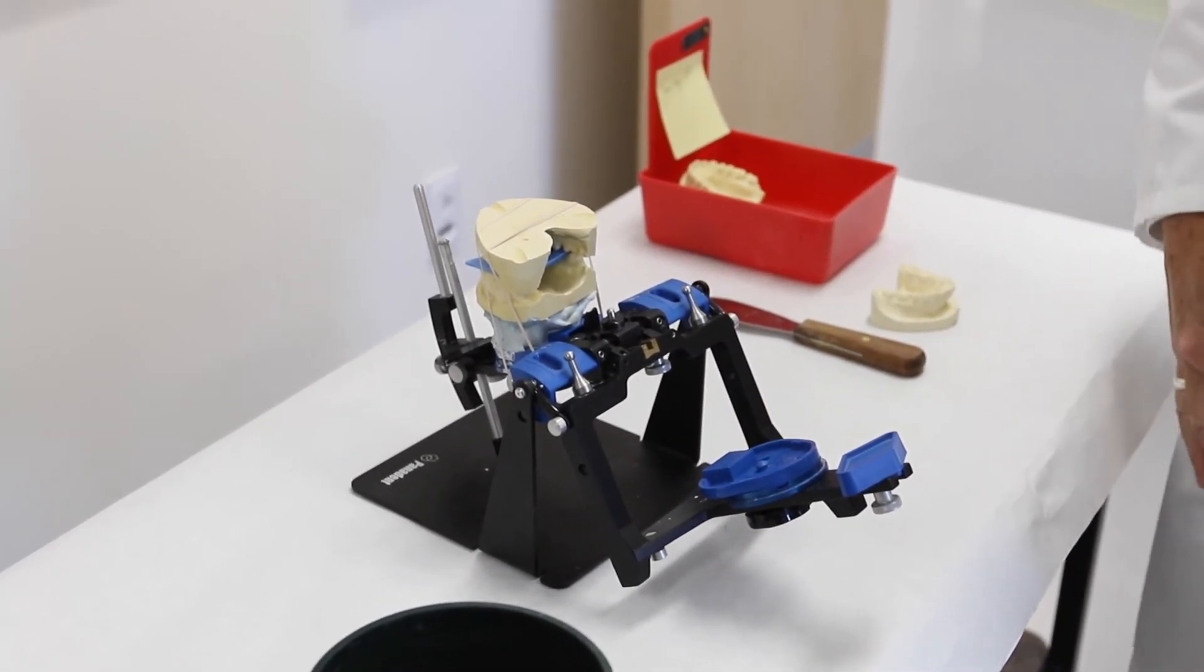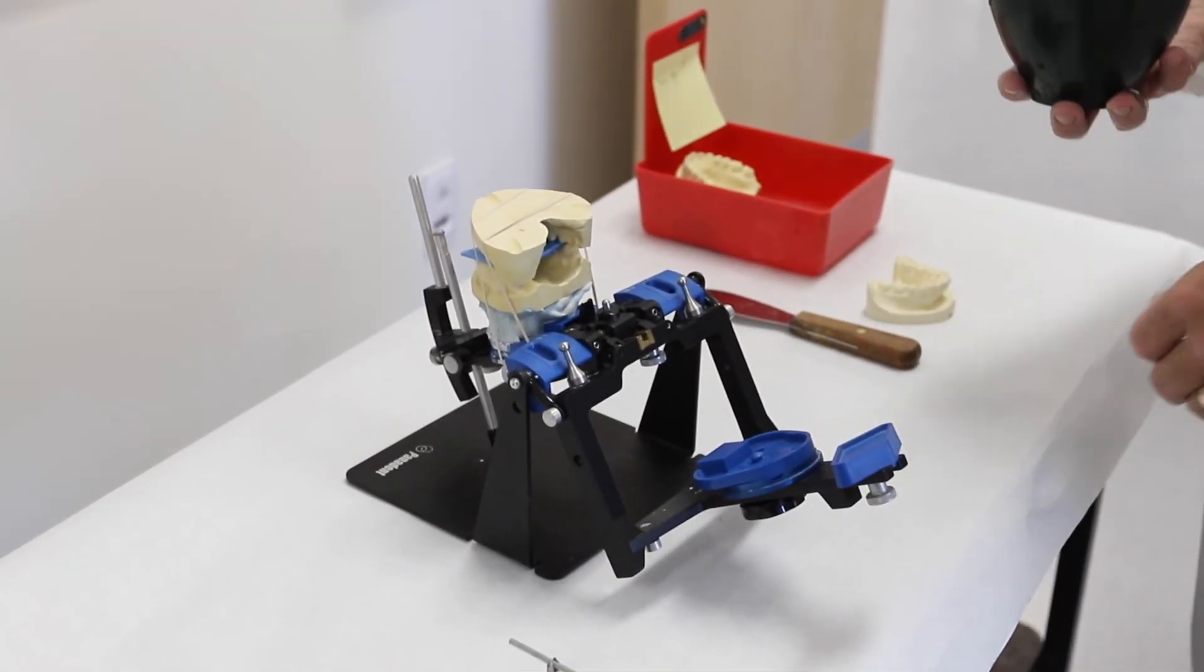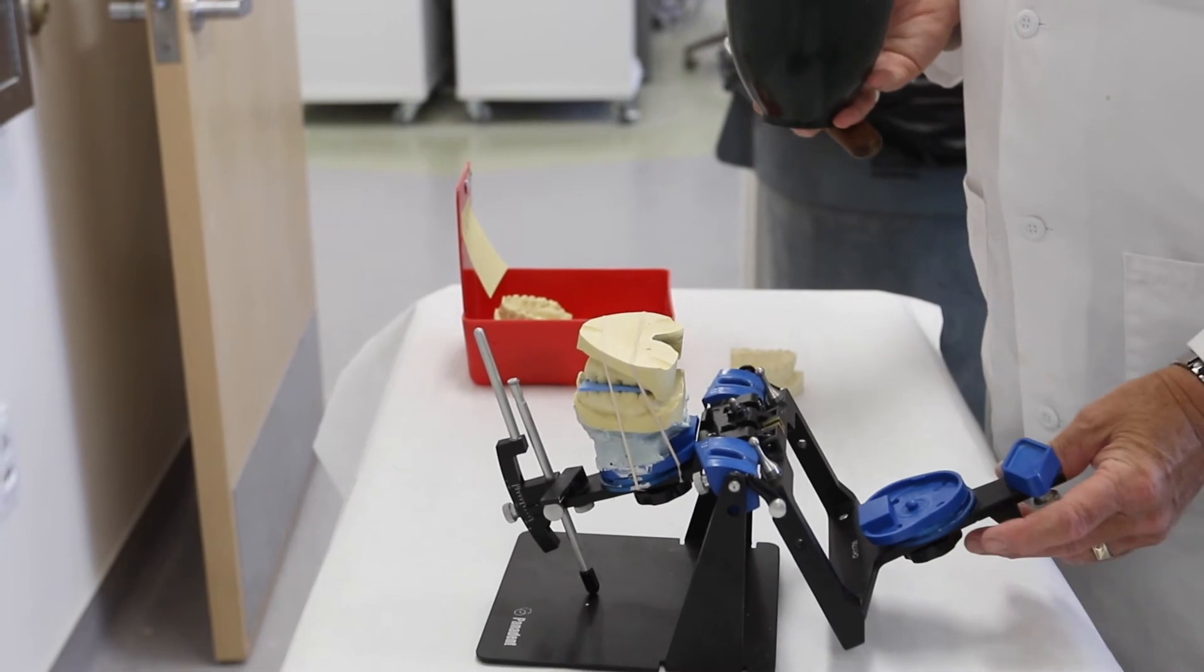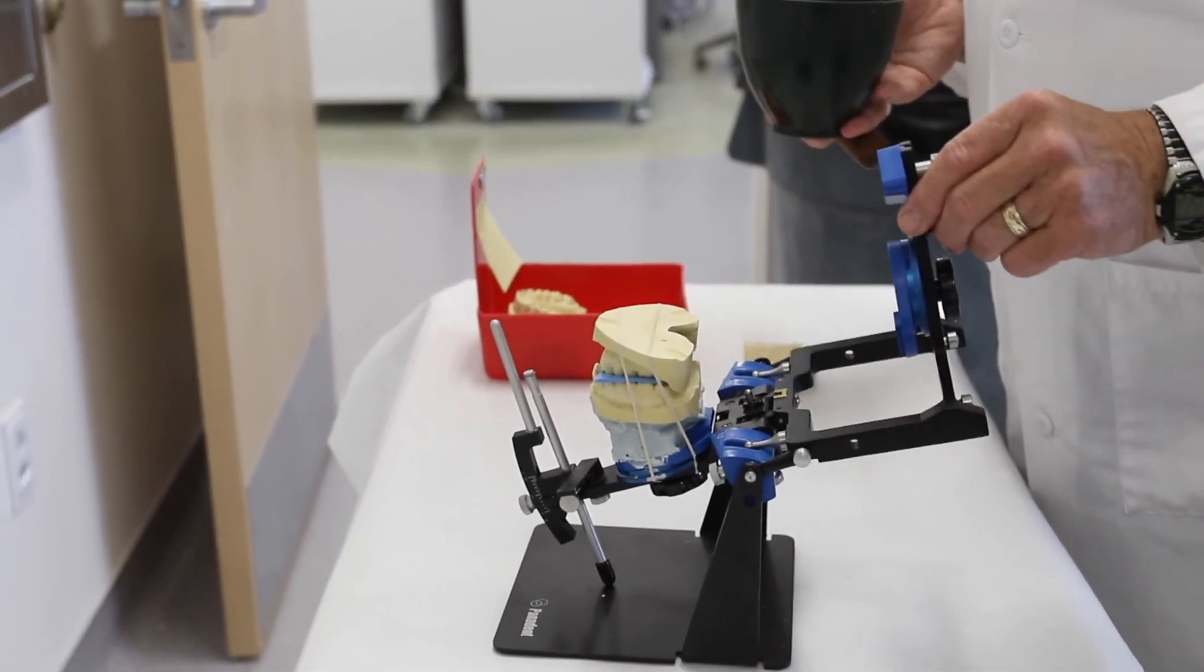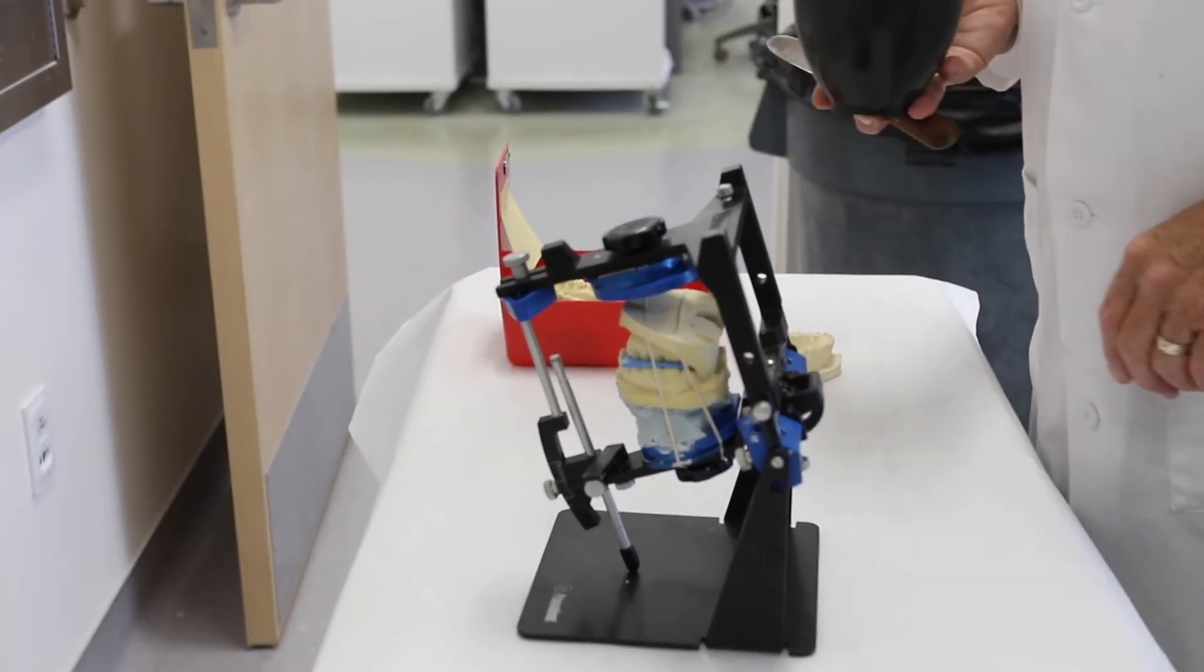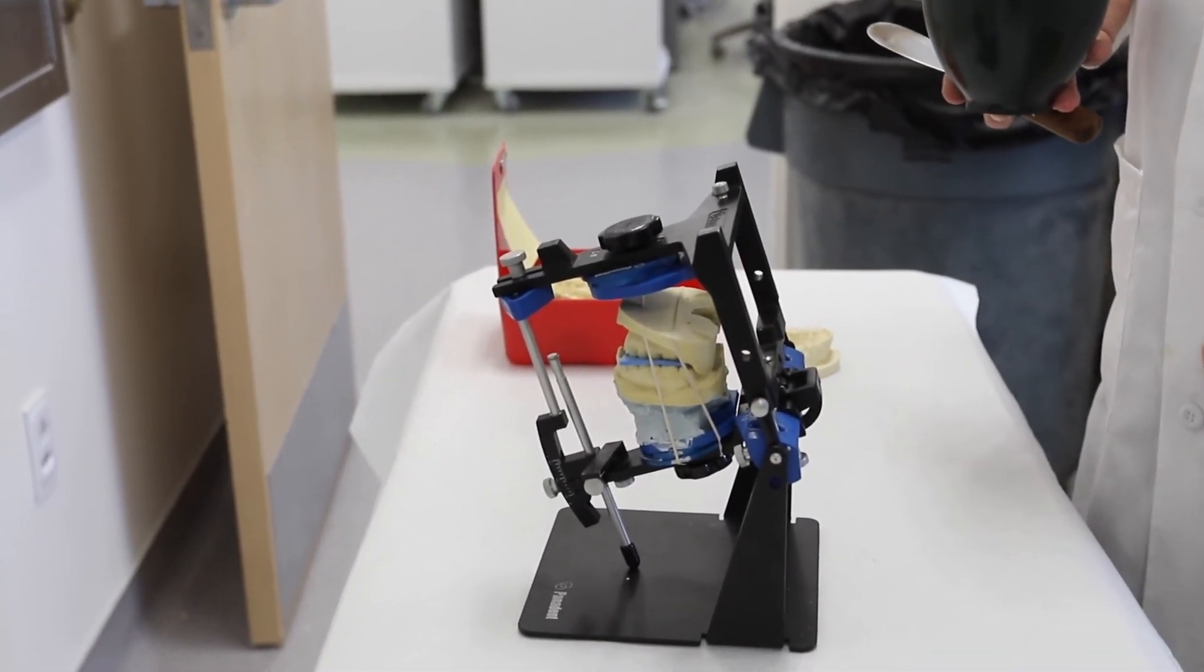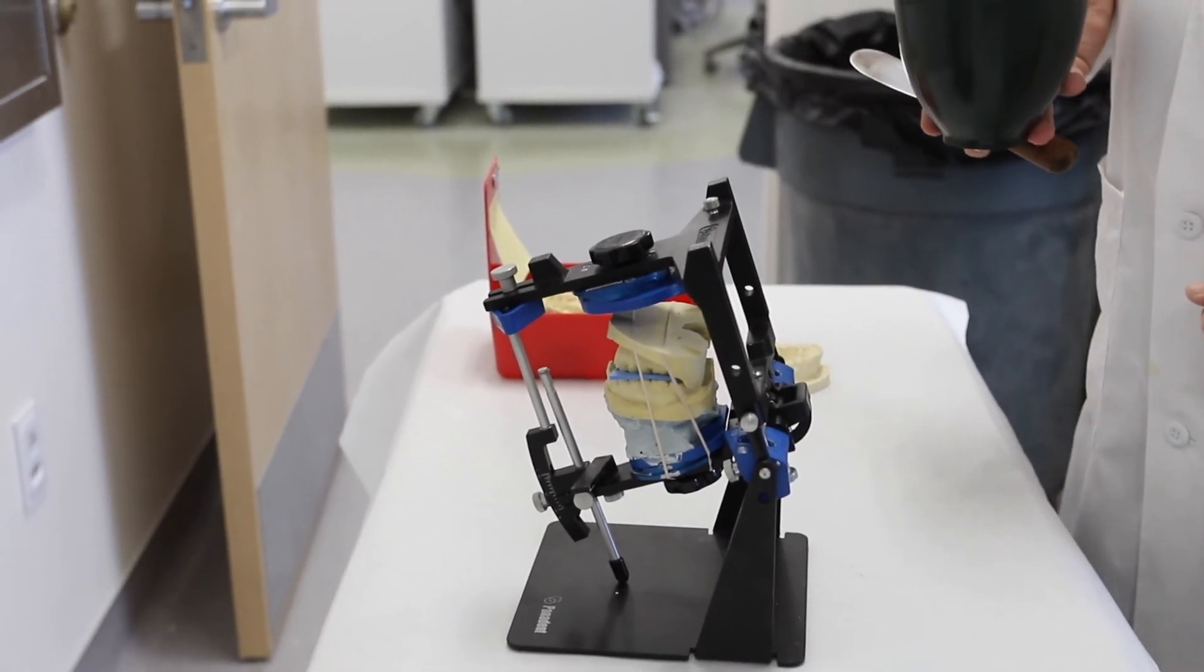We're now ready to add the mounting stone so we'll mix that up and also demonstrate how that is done. At this point it's also a good idea to estimate how much mounting stone is going to be needed to put the mounting stone into the gap that remains between the mounting plate and the lower model.